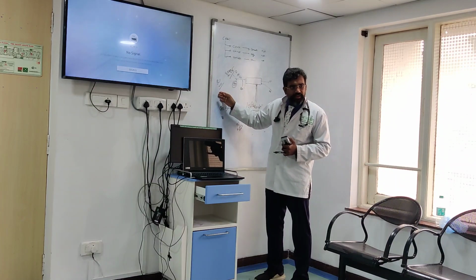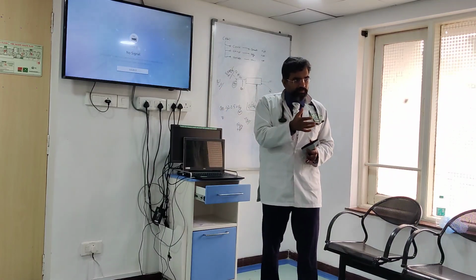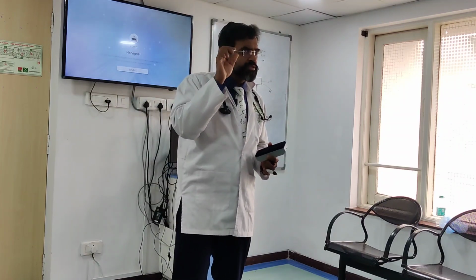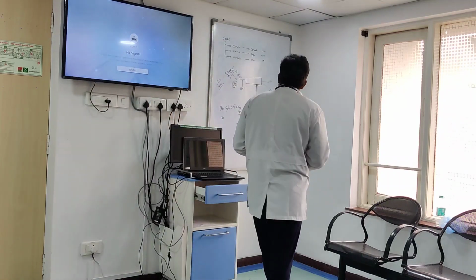Are you understanding? So you must remember, when I'm starting my CRRT machine, I must ensure that my blood pump flow is 2 to 2.5 times my dialysate flow. Simple principle, very simple principle. This is in case of CVVHD.